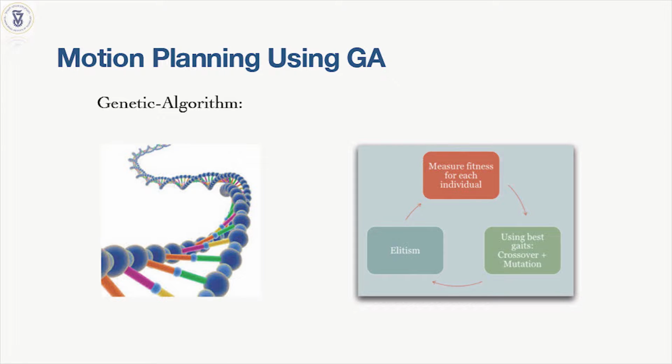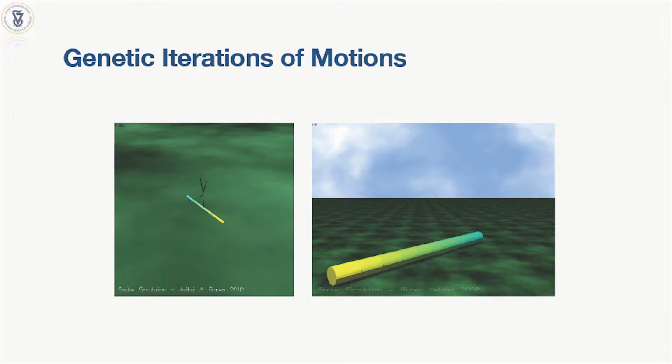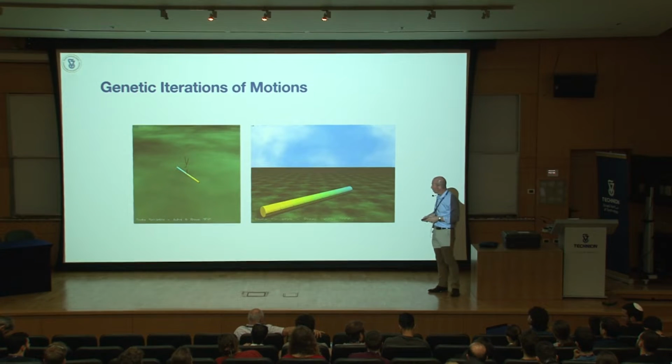I don't need to teach you here in computer science what is genetic algorithm, with all the mutation, taking a few successful motions, creating a third successful motion, giving an objective function, good motions remained, bad motions were extinct. The genome, the cells, were the motor commands that we were sending to the robot.